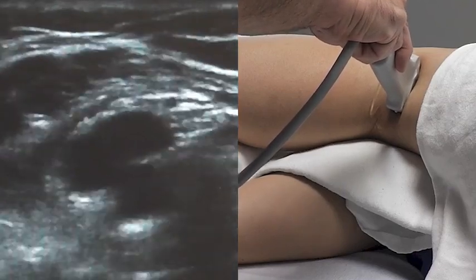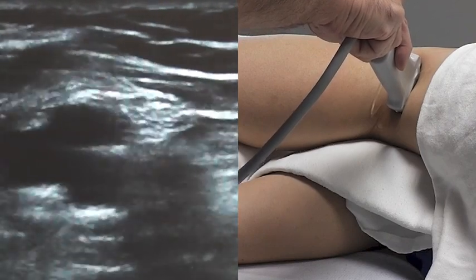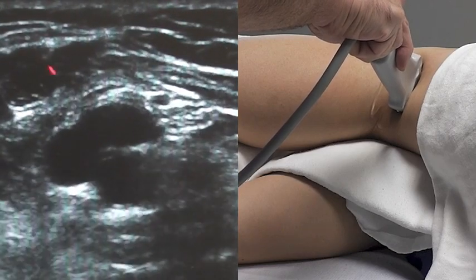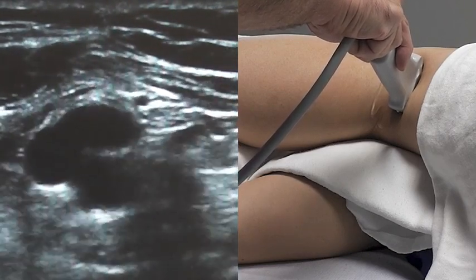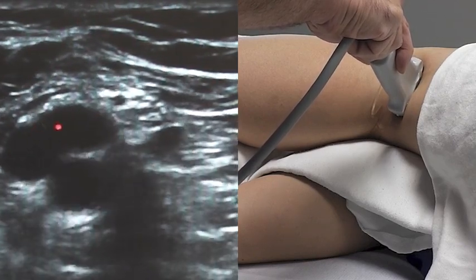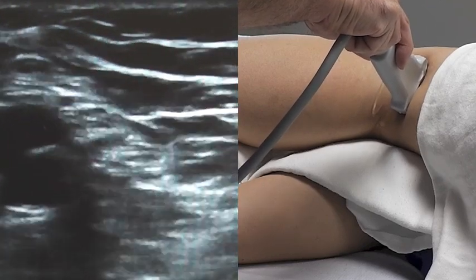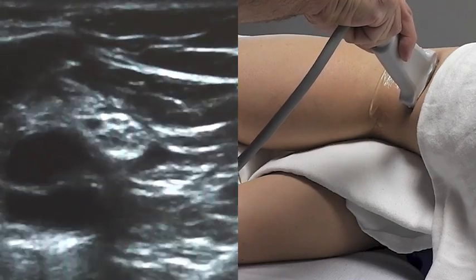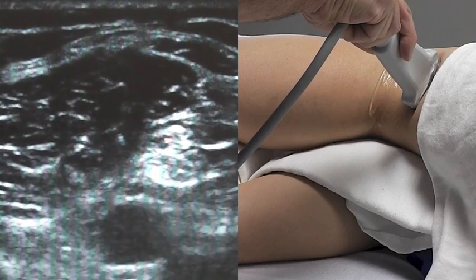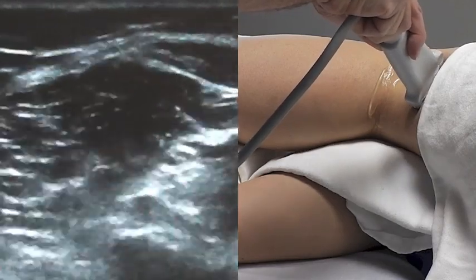When I do this block, I want to make sure that I'm not doing it at the level where the nerve has split. When you block there, it's very possible to have a positive twitch if you use a twitch monitor, and to have a poor outcome because you're blocking only either the lateral aspect — the peroneal component — or the medial aspect — the tibial component. So I want to move the probe cephalad to ensure that I have the whole sciatic nerve, which I do now. I'm happy blocking anywhere at this level or even a little bit higher.